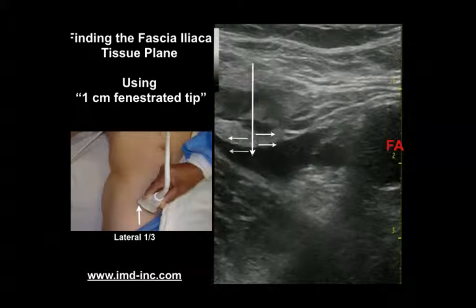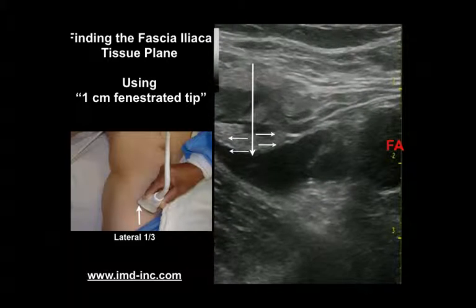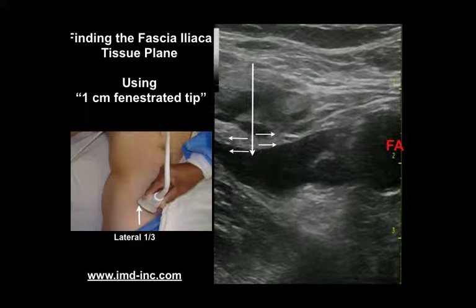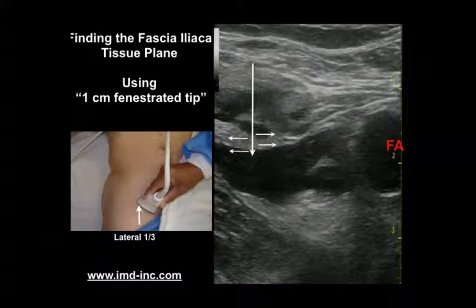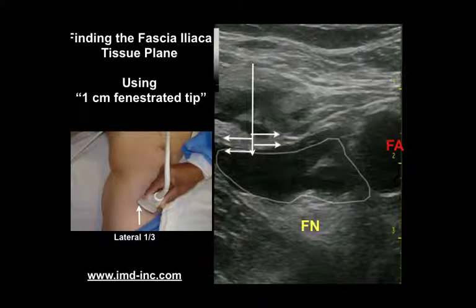And at the completion of the injection, there is a large amount, in fact the predominance, of the local anesthetic in a tissue plane which is superficial to the femoral nerve but deep to the femoral vessels, illustrated by this outline. Thank you.